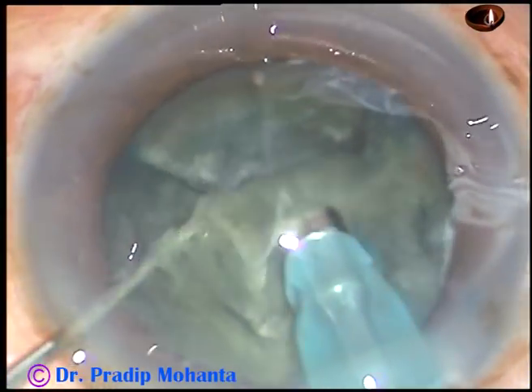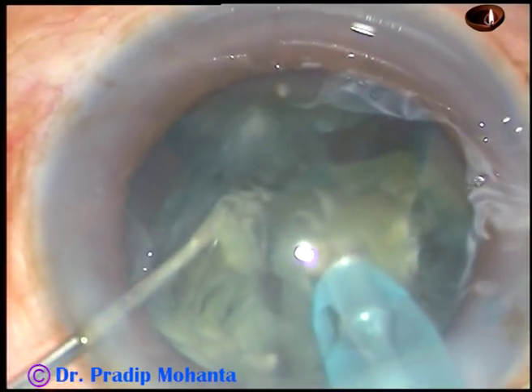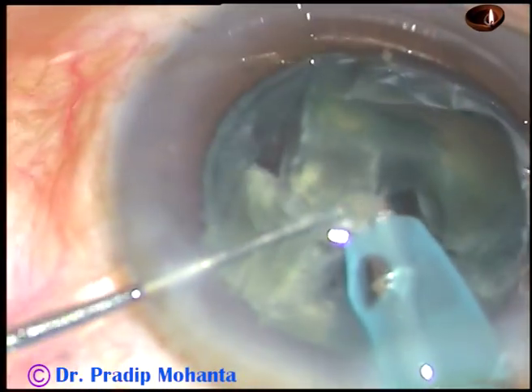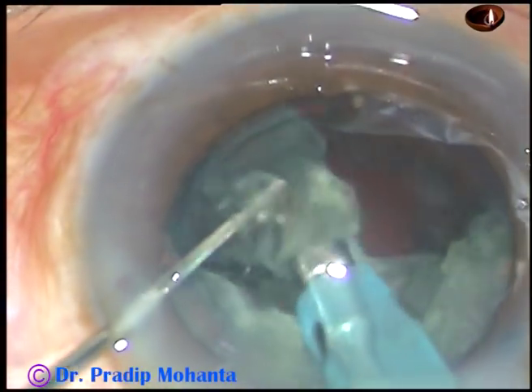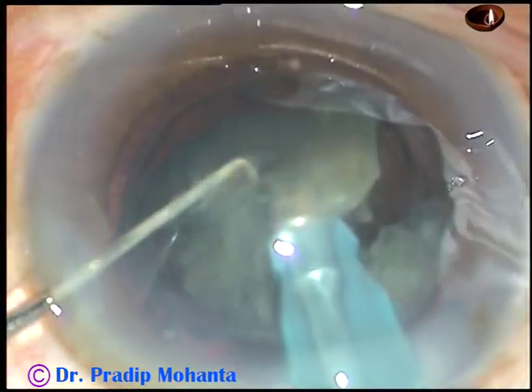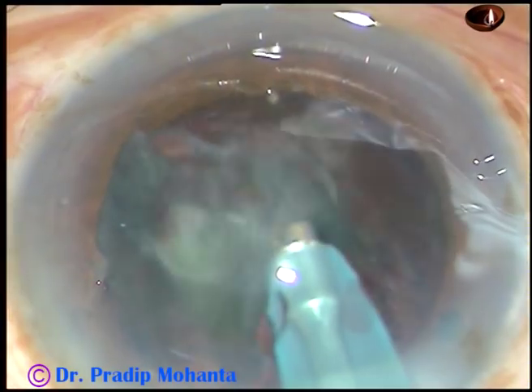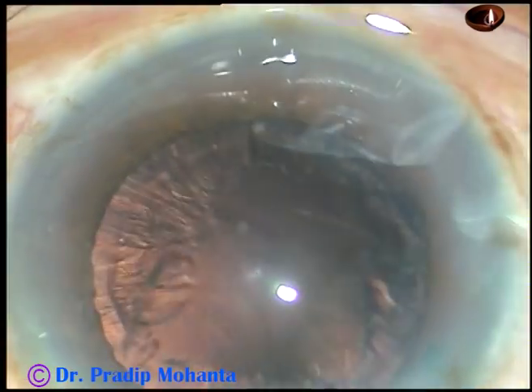You can see that the consistency of the nucleus in this case is such that you can chop it very easily. The nucleus is almost managed. And this is a big, thick epinuclear piece. And this is nucleus again, and this is also nucleus. We are towards the end of the nucleus and epinucleus management. Remove the chopper towards the end.